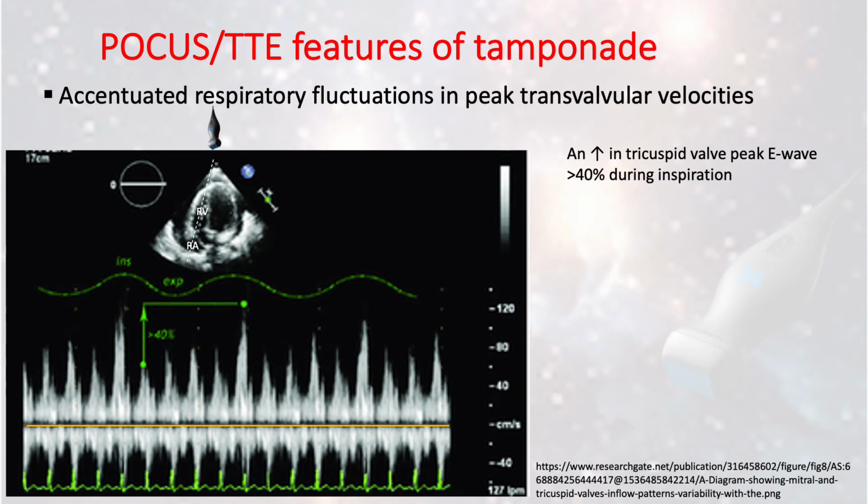while you're on the apical view using ultrasound, or when you're doing the echo, you can use the spectral pulsed wave Doppler option and move the line across the tricuspid valve. Now, what is spectral pulsed wave Doppler? It means you are asking the ultrasound machine to measure the blood flow velocity across the area that you picked, and in this case it's the tricuspid valve. Any flow towards the probe will be reflected by waves above the yellow line, and the flow away from the probe will be reflected by waves below the yellow line.